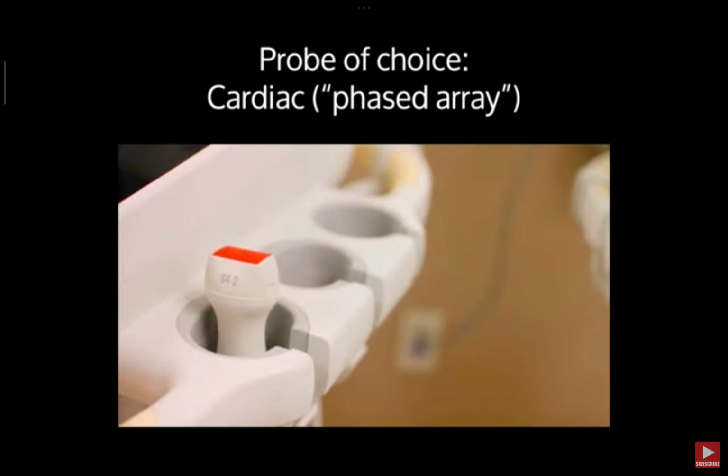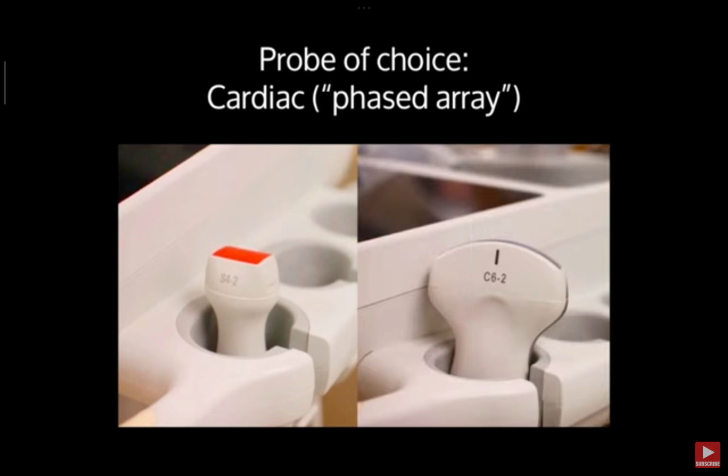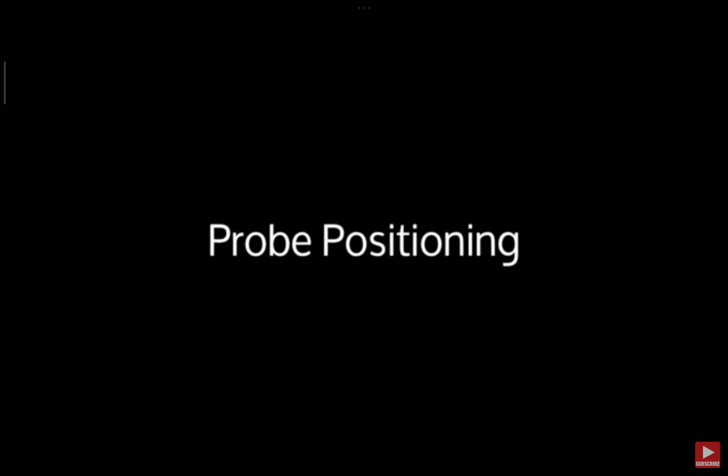For this examination, the probe used is the cardiac probe, aka the phased array probe. This probe is great for fitting in between the rib spaces. If your machine does not have this probe, the curvilinear probe can be used, but really the preferred probe is the phased array probe. First, we need to talk about probe positioning.